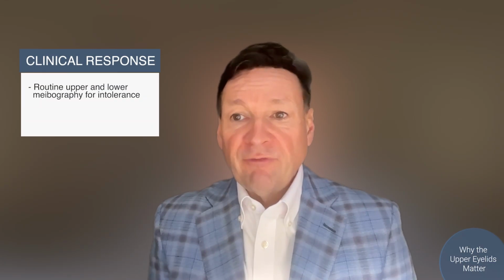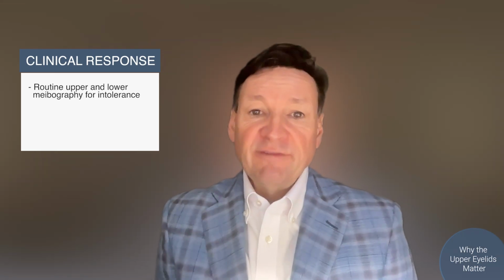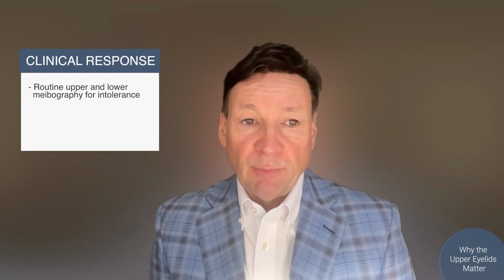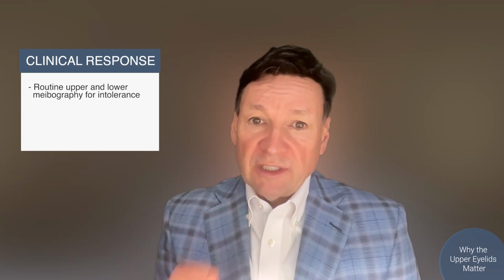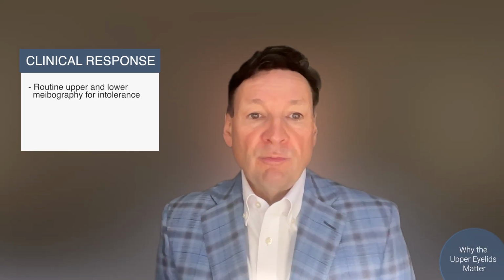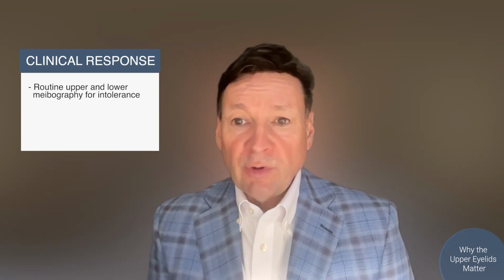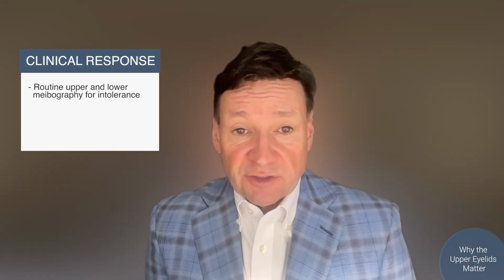In my own practice, when a patient presents with contact lens intolerance, I now routinely perform upper and lower eyelid meibography. If I see significant upper eyelid tortuosity, even when the lower lid looks acceptable, I change the conversation. I explain, your lower lid glands look relatively healthy, but your upper eyelid glands show mechanical stress from lens wear. Without intervention, you are at high risk of losing lens comfort over the next several months to years.